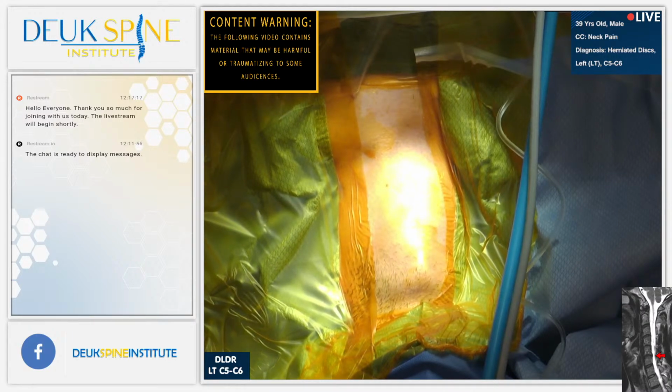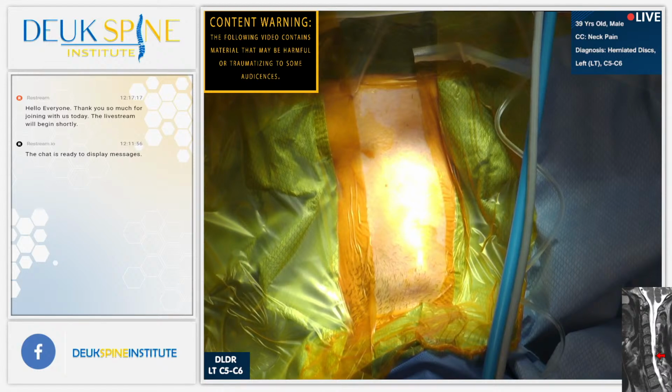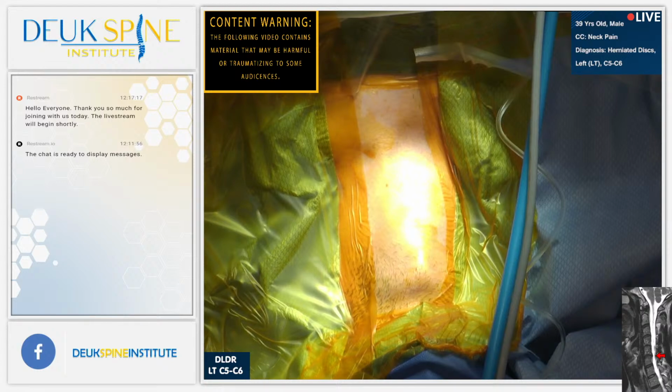So the two most common causes of pain in the neck are disc herniation with annular tear, called discogenic pain, and facet joint pain. He did not have facet joint pain, and on MRI, right where he was pointing his pain was C5-C6. There is a herniation there with an annular tear. As you can see, thank you, Luis, from his MRI, the herniation is not big, it's small. But small things do cause big problems. So we believe his one herniation at 5-6 is the cause of all of his neck pain and headaches and pain radiating into his shoulders.